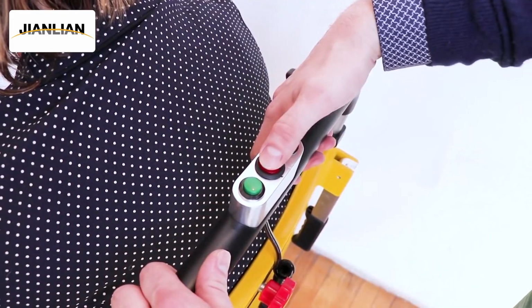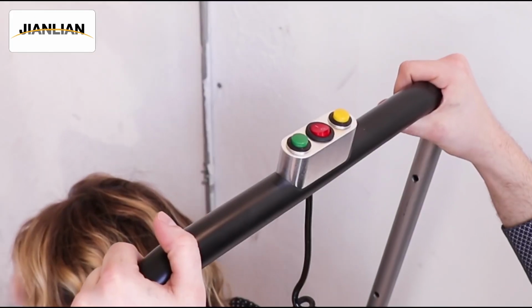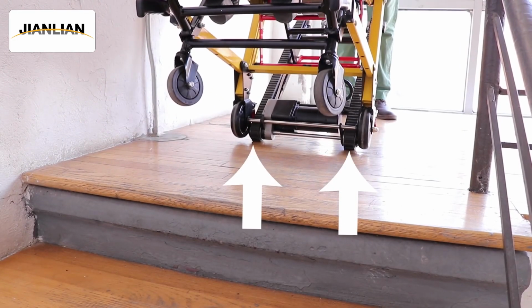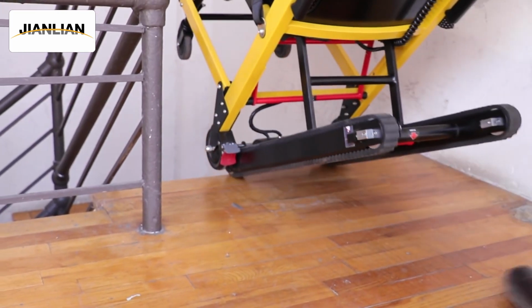Power on the stairlift and rotate the red knob behind the stairlift to extend the handlebar. Use the handlebar to lean the chair back onto the bottom tips of the treads until the treads sit at the approximate angle of the staircase you are planning to descend. Then press the yellow button to begin descending the stairs.